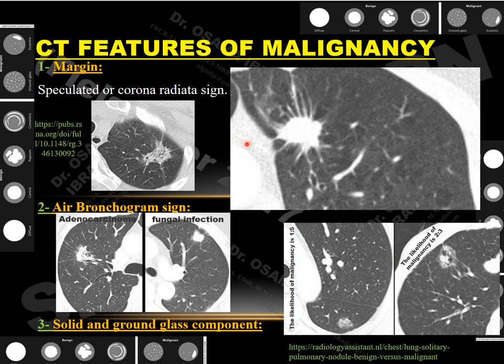The second feature is the air bronchogram. The presence of linear and dot-like lucencies within solid nodules raises the possibility of malignancy — this one was adenocarcinoma — compared to solid nodules without air bronchogram, which was a fungal infection. Also, the presence of both solid and ground glass components within a nodule raises the possibility of malignancy, particularly when there are solid components alongside cystic and ground glass components in a sub-pleural location with irregular outlines.